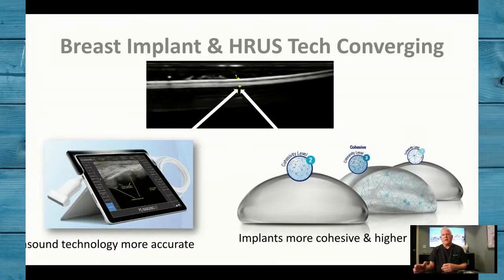We're changing that business into more education and credentialing of plastic surgeons. But just now, high-resolution ultrasound is really taking off nationwide and globally. It's taken much longer than I thought, actually. But we've been using ultrasound for a long time. Starting about 2 years out, we have patients come in and scan their implant. We've incorporated that into their post-operative visit. While we're asking about their new dog and a new house, we're just scanning their breast implant. And I can tell you within 1 minute the status of your breast implant.